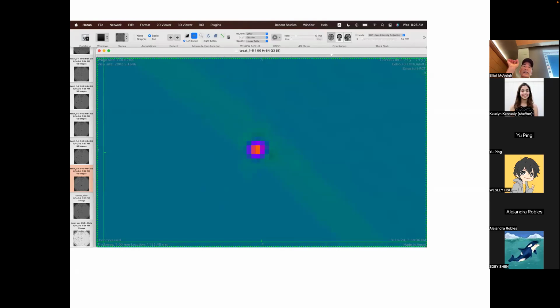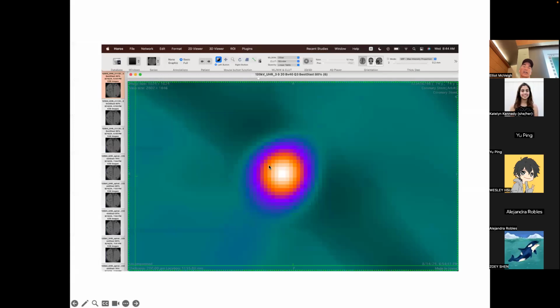Okay, so this is a really small dot. We'll zoom in closer, and it creates this picture. So here's the object, here's the picture. And so this picture is the point spread function. Ideally, this dot would be even smaller, such that I would get a picture like this, where my dot is a tiny thing here, and I get that kind of resolution as to what an image of a tiny dot looks like.